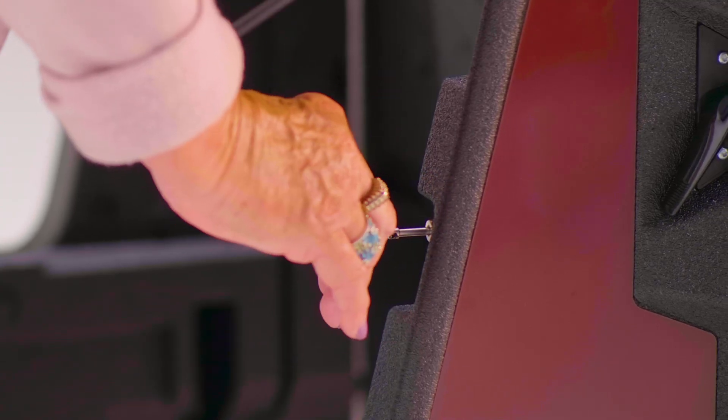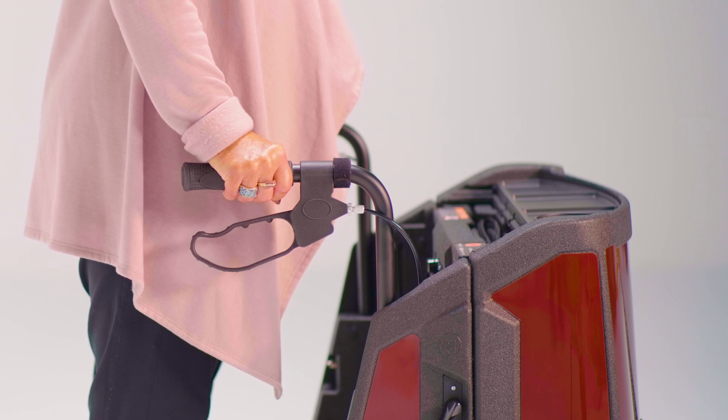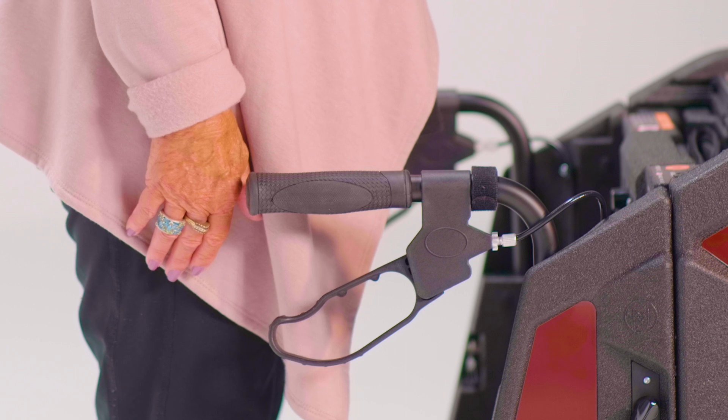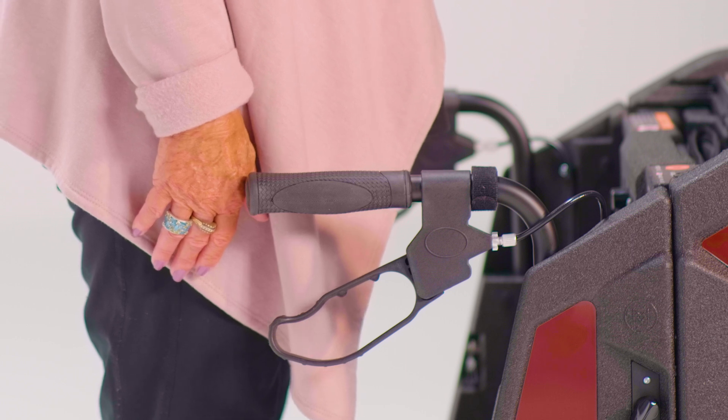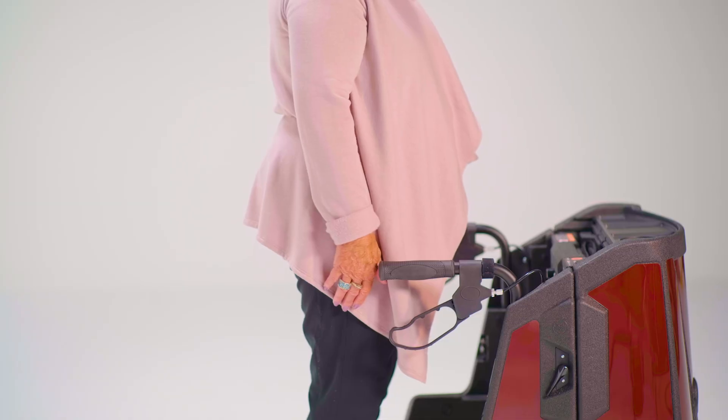After that, you may need to adjust the height of the handlebars. Always consult with your health care provider as to the correct handlebar height for you. A place to start may be to stand inside the tour with your arms at your side and adjust the handlebars so that the hand grips line up with where your hand meets your wrist.